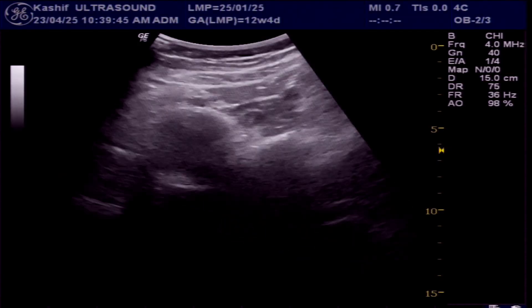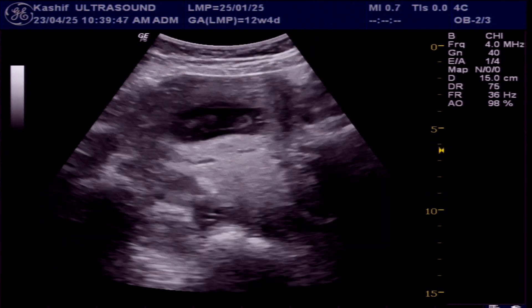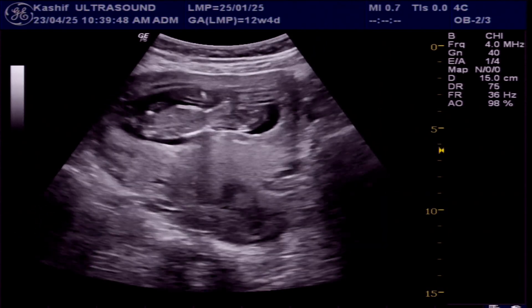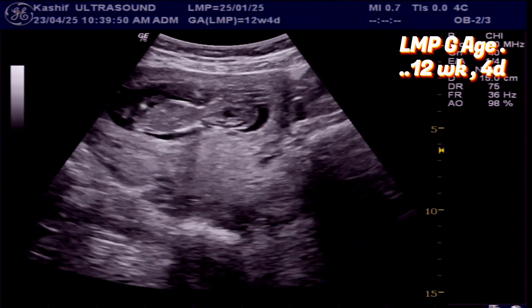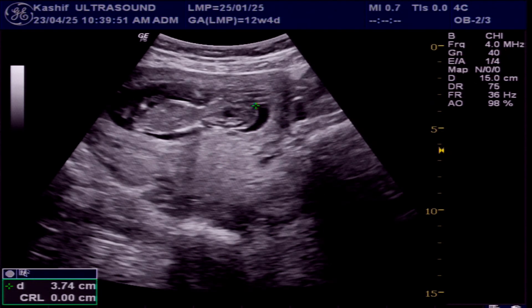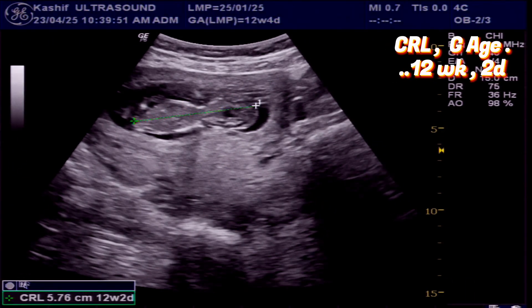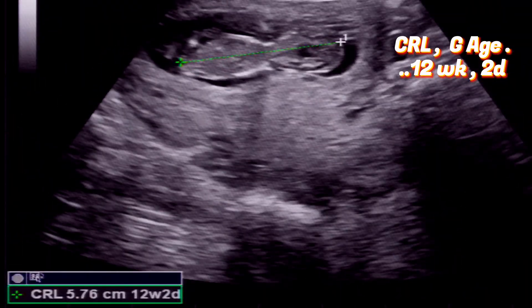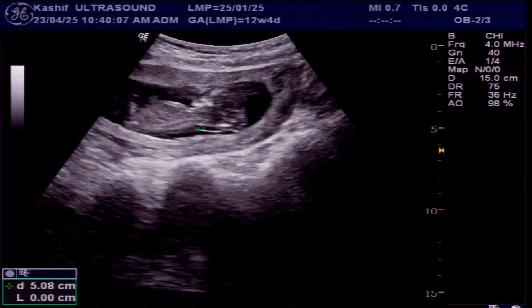This is an obstetrical scan at the end of the first trimester. According to LMP, the gestational age is 12 weeks and 4 days. According to CRL, which is used to measure the gestational age, the fetal gestational age is 12 weeks and 2 days. This is normal.